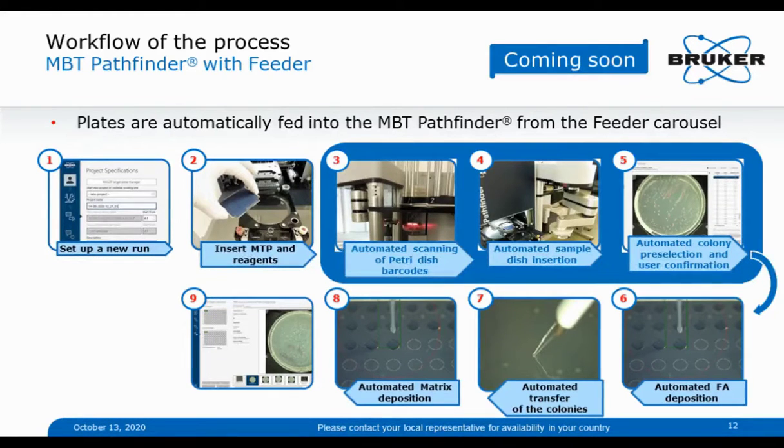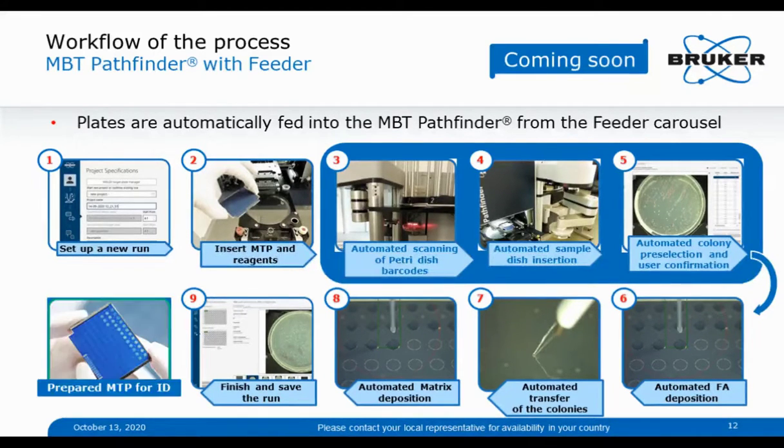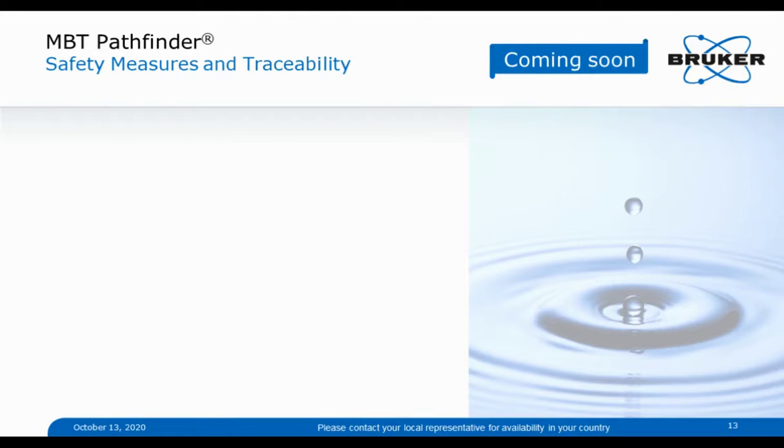After drying of the sample, matrix is automatically deposited. After that has been done for all samples, the run is closed and finished. The sample can be introduced with the target plate into the MALDI Biotyper for analysis.